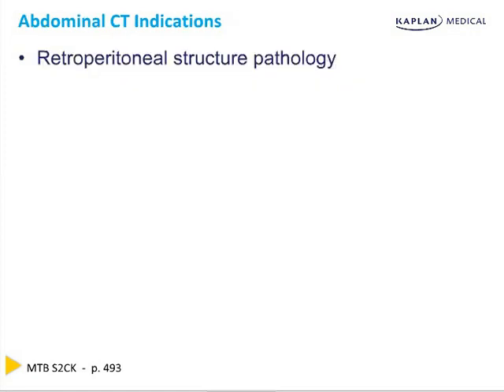Let's now move on to a second region of the body where CT scans are commonly utilized, the abdomen. When evaluating organs in the abdomen, you really should only consider two imaging modalities, CT scan and ultrasound. We will talk about ultrasound at length in the next lecture, but it is generally poor at looking through bony structures due to the shadows that bone casts, and is also poor at looking through air-filled structures like the bowel, because air refracts the sound waves. Thus, its use in the abdomen is somewhat limited to evaluating the gallbladder, liver, kidneys, and female reproductive organs.